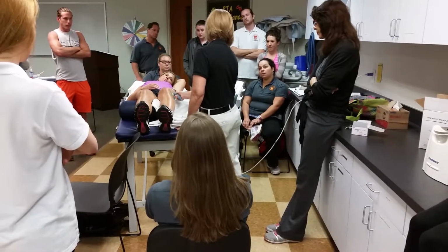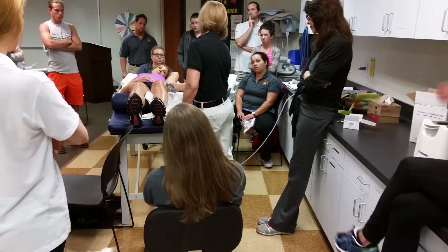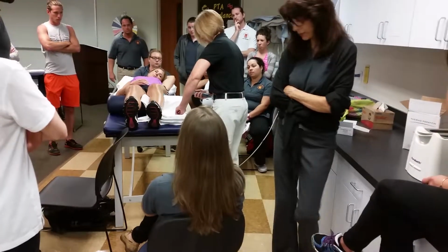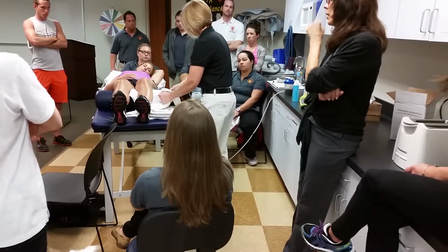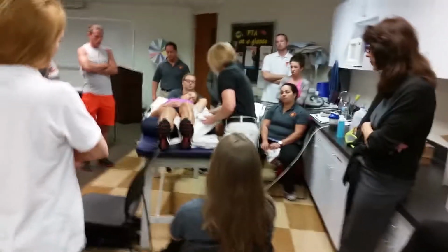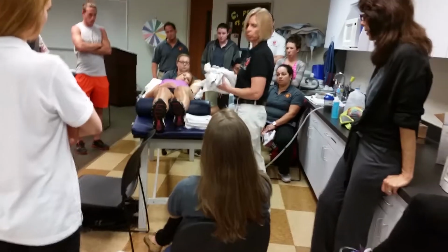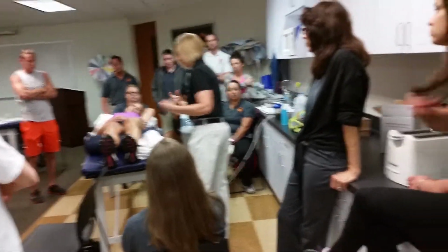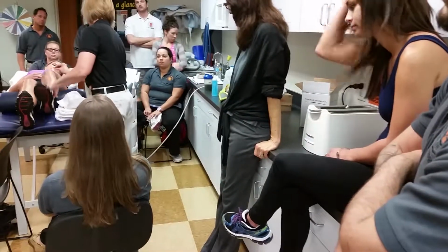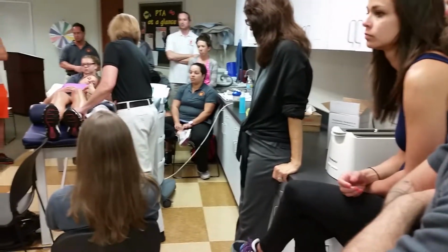If you're doing gait training, for example, you need to put in the amount of assistance and the type of gait pattern. That doesn't go in assessment, it goes in objective. Okay? So that tells me we're done. Sound head off, put it down, and then skin. Now, ultrasound gel can get itchy. I know when I've had treatments, it drives me nuts. So you might want to get it off of her so she's not going to get itchy.